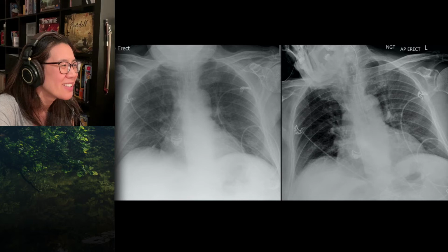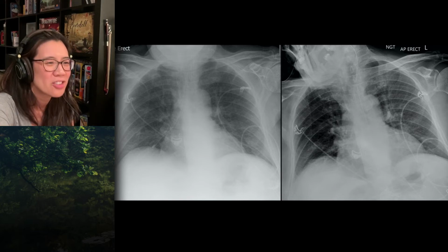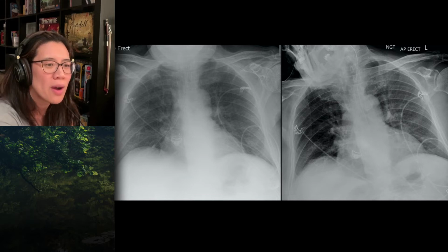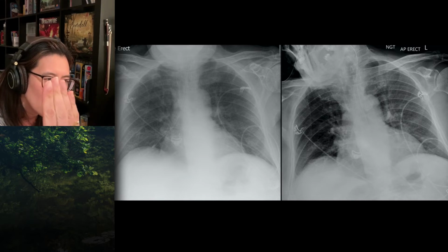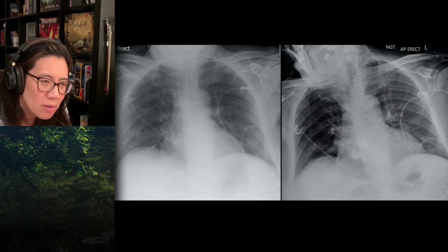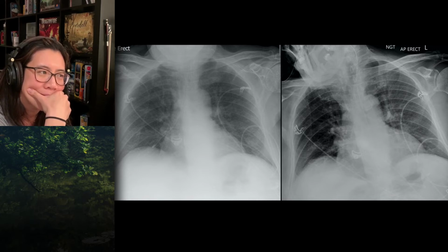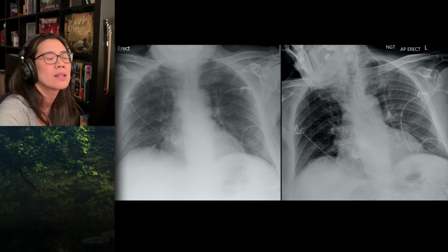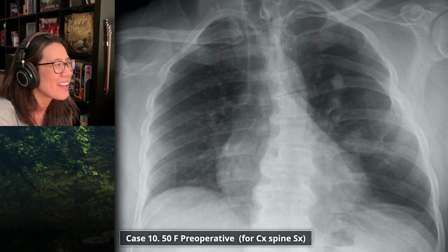I'm not laughing. And the X-ray the following day was totally normal also, so I'm sure it's just due to rotation. Yeah, cool. And also I think, like the last one, the soft tissues on the left look more dense compared to the right. They always do when you're rotated because you're going through more tissue. The paraspinal soft tissues and the lateral soft tissues are projected over the lung instead of the medial soft tissues. Yeah, cool. Next. Excellent.